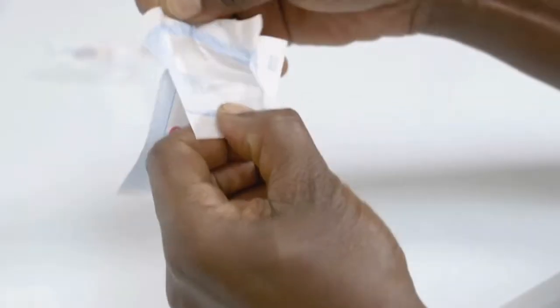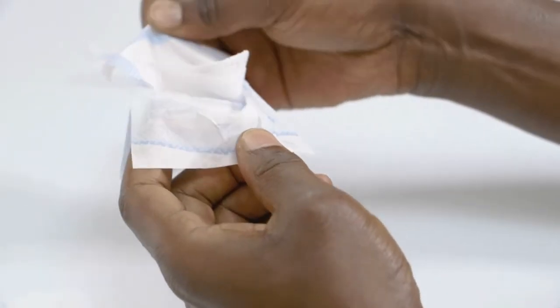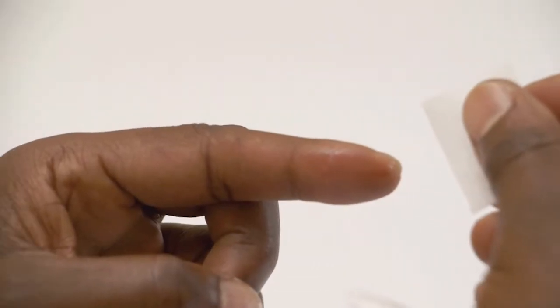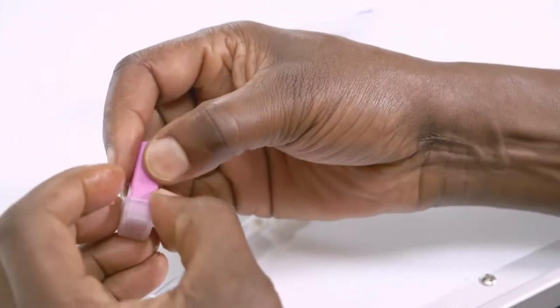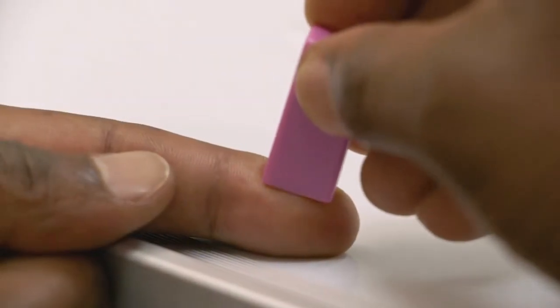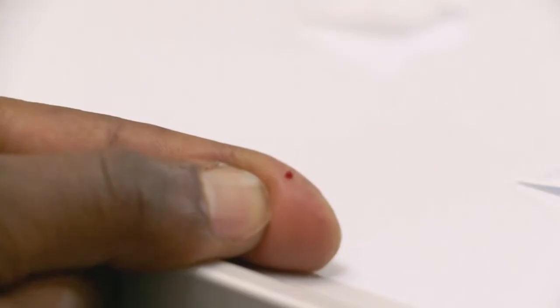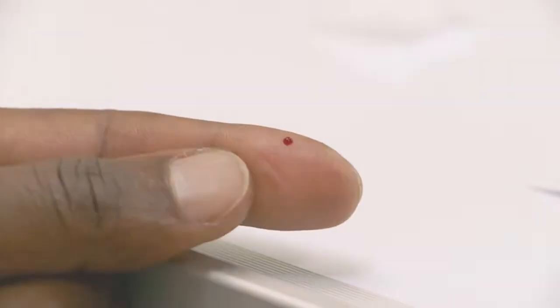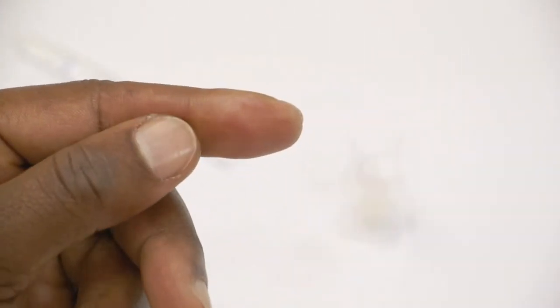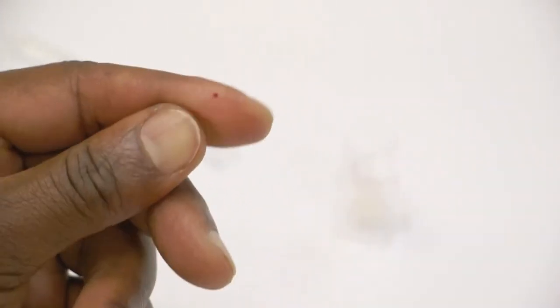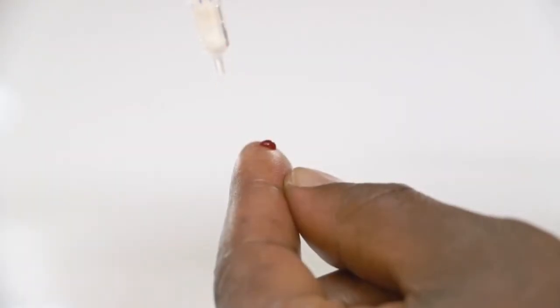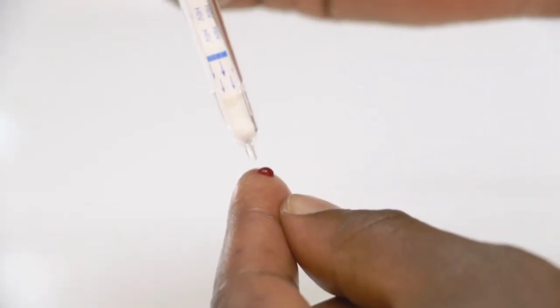Open alcohol swab and sterile gauze pad. Clean finger with alcohol swab. Uncap the safety lancet. Break your skin and squeeze out the first drop of blood. Wipe away first drop of blood with sterile gauze pad. Squeeze out second blood drop. Fill tip of testing device with blood.